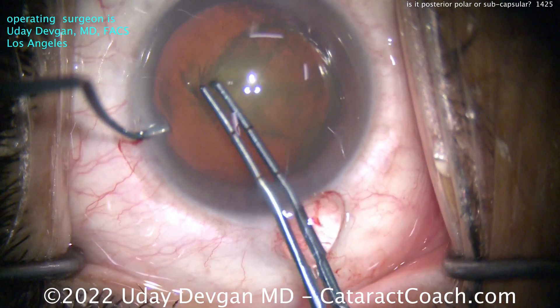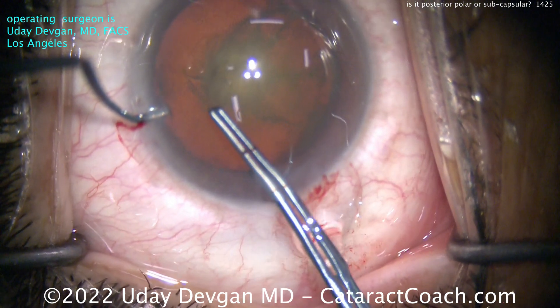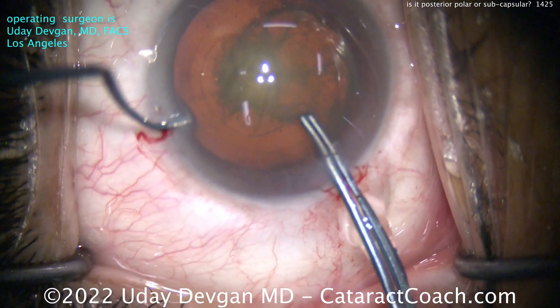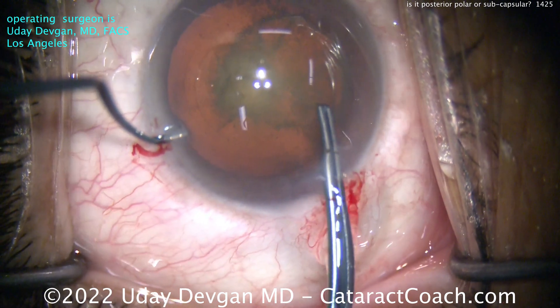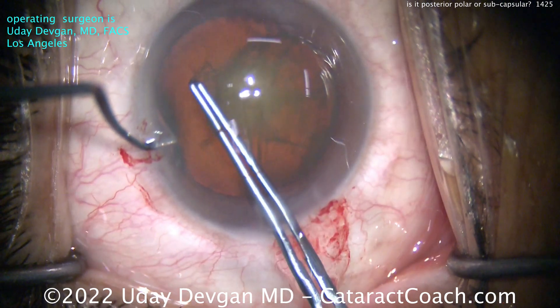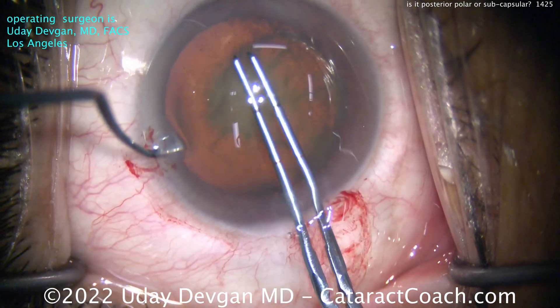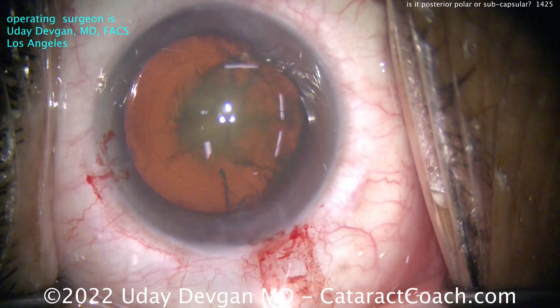First things first — let's start with the rhexis. Definitely make a 5mm rhexis, because just in case you have to place the haptics in the sulcus and use a three-piece lens and capture the optic behind the rhexis, at least if you have a 5mm well-centered rhexis it'll make life easier and give you more options. We want to make sure we take our time on that. And I think you'll agree that's a pretty good rhexis, about 5mm.